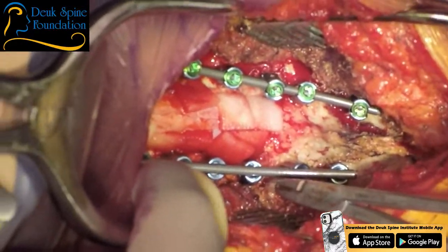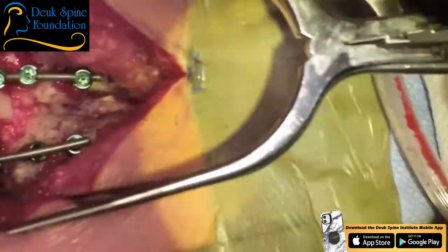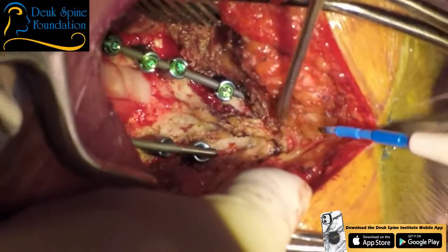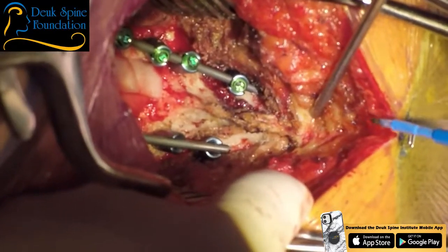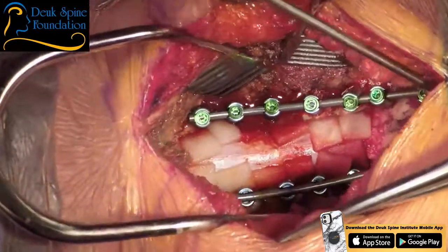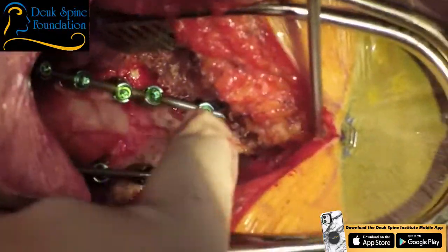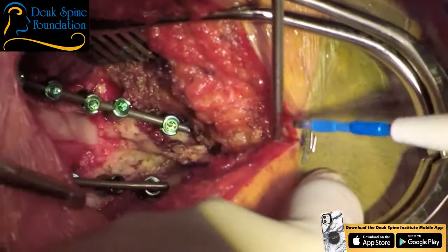All right, that will pull that up. That will derotate that. We have a little bit of bleeding from somewhere. Let's see where that is. Let's suck. It's coming from up here. I think it's from right here. See it? I don't see it. All right. Let me have a rod holder. You found it? Okay. Where's my Bovie? Nice job, Dr. Patel. I love the persistence.